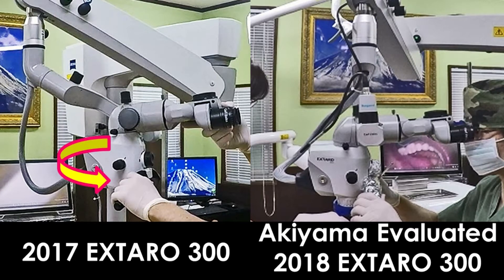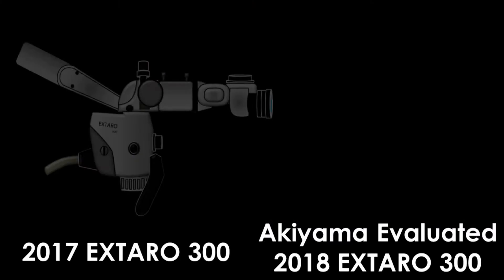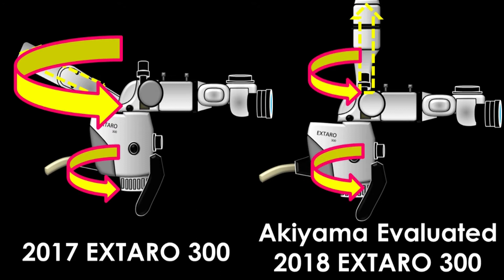Akiyama evaluated the 2018 EXTARO 300. It is improved — easy to move, easy to turn independently, as you can see.